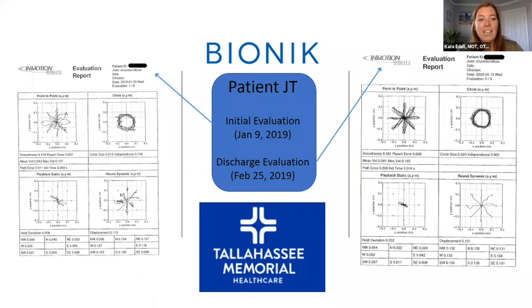And she's asking, do you ever have the patient do mental imagery during physical rest breaks while using the arm robot? Huh. Great question. That is a really great idea. No, I have never done that, honestly. But now I really want to. That gives me a really good idea. Yeah, no, functional therapeutic rest break. Yeah, yeah. Sheree, have you seen that? I haven't, but I'm on board with Sue. This sounds like something we need to be encouraging people to do. Congratulations on giving us a new idea. Yeah, I'm writing it down.